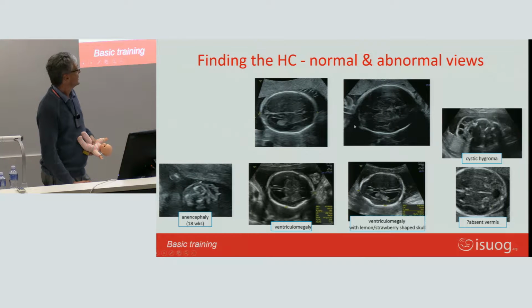Yes, so you can see there's the Sylvian fissure, and there you can see it's much more convoluted. The whole cortex is much more convoluted. You actually start struggling seeing the cavum septum pellucidum, and the ventricle, which is basically the same absolute size, becomes relatively much smaller later on.